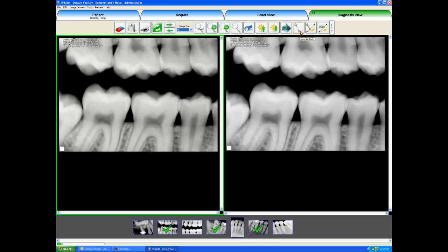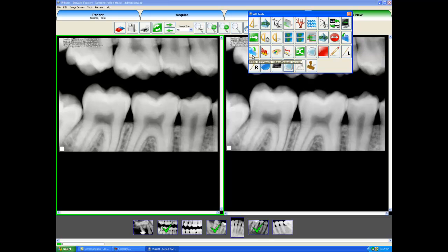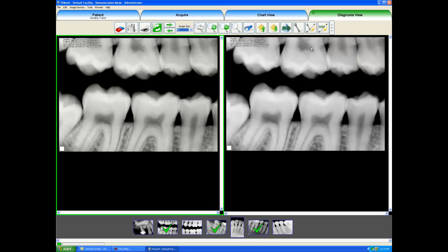It is important to come up to the view all tools menu and play around with some of these different tools. You can add comments to an image, you can take angle measurements, you could put a left or right marker on an image, or you can draw lines and pointers on an image. With the rotate buttons, you can also rotate an image should it show up as backwards if you took it on the other side of the patient's mouth. If we wanted to save our changes to an image — which would not overwrite the original image, it would only add a different view of the same x-ray — you can click on the save current image icon. Thank you very much, that is the Diagnosis View.